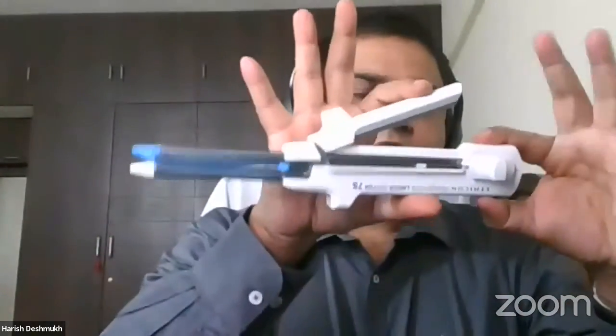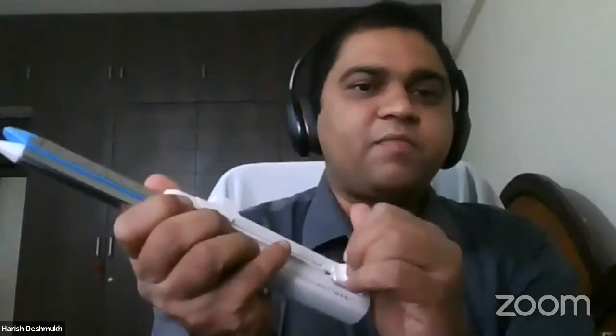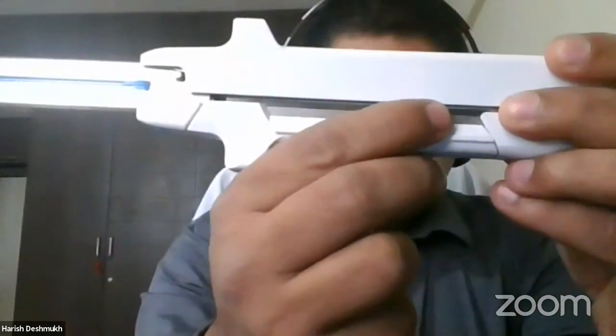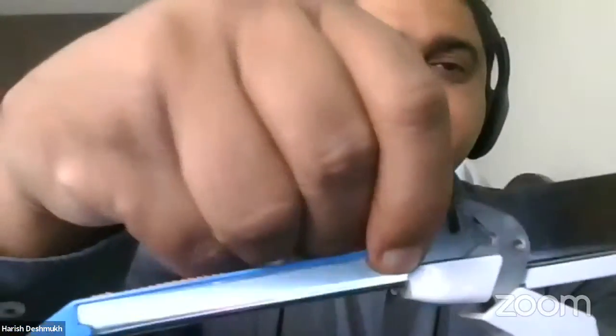After that, close your closing trigger, and you have a firing handle. You can just go ahead with the firing knob. You have to use it and fire it in one stroke till the end. Then you have to come back to the original position. For opening again, we have grooves available here. You just pull it down and it will open up. After that, you can see some grooves here, based on the color of the cartridge. Hold it from both ends, pull it, and discard the used reload.